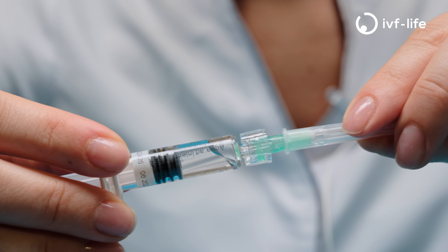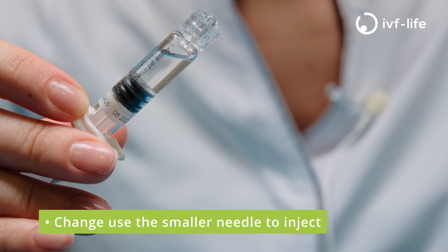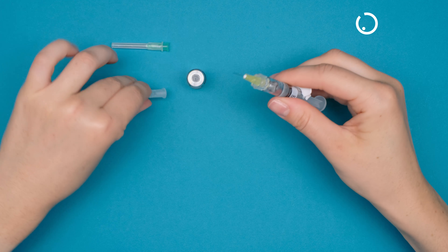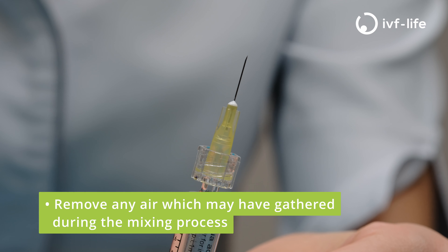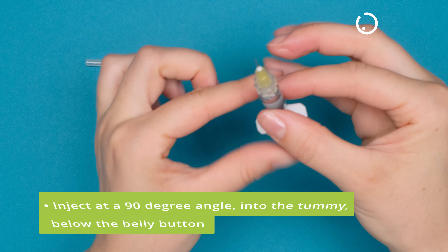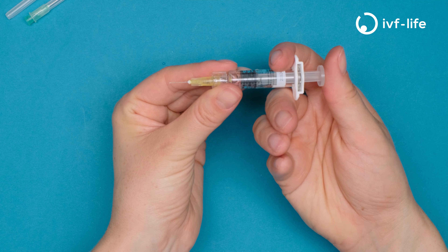Now we change needles. We will always inject with the smaller needle. Twist and remove the larger needle, then twist and connect the smaller needle. Be sure to remove any air which may have gathered when mixing and withdrawing — push slightly to make sure we get rid of all the air.